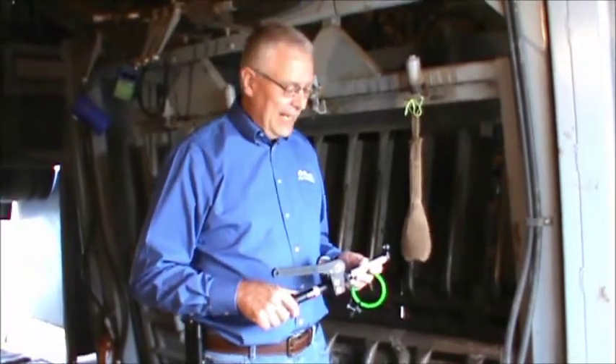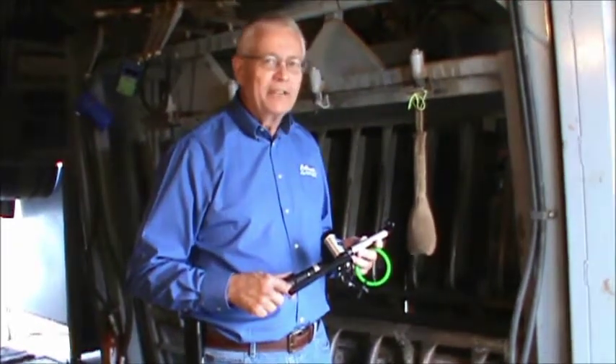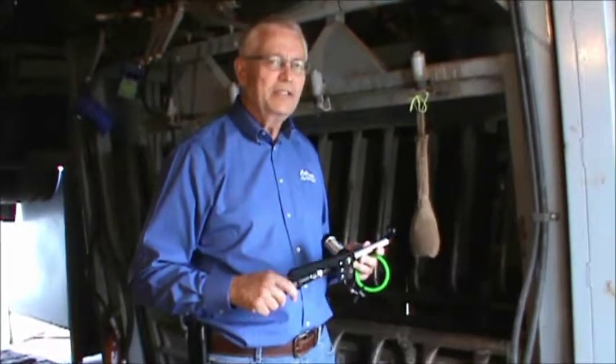Hi, I'm Roy. Today I'm going to demonstrate the proper use of the CaliCrate ProBander. ProBander is a very simple tool to use, but there are a few things that you need to be aware of to achieve 100% success.